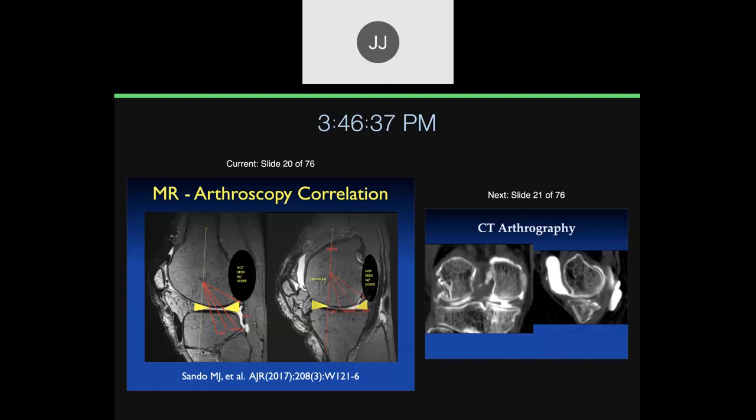He went in and put suture anchors at the margins of what he could see arthroscopically, so we have MR scans showing where the suture anchors are. MR and the gross specimens correlated very well. Once we realized that large areas were not seen by the arthroscopist, we found we picked up a lot more lesions on MR than at arthroscopy, because they were in areas blind to the arthroscopist. The arthroscopist actually picked up a few more lesions in the areas they could see, because they have much higher resolution.